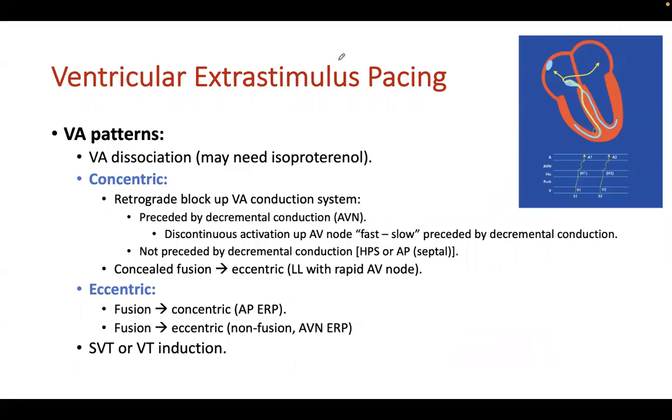Okay, so back to ventricular extrastimulus pacing. Sometimes we do see VA dissociation, meaning you are not conducting retrograde and activating the atria. So if this was the case, usually the SVT in this patient must be either atrial or maybe AVNRT, but this is also rare. Usually atrial. This favors atrial.